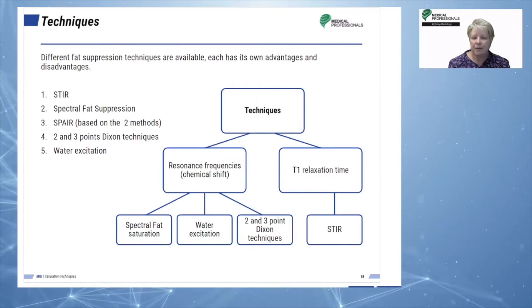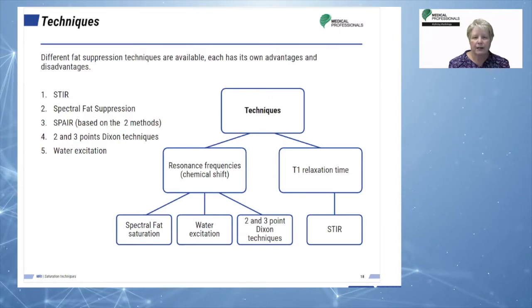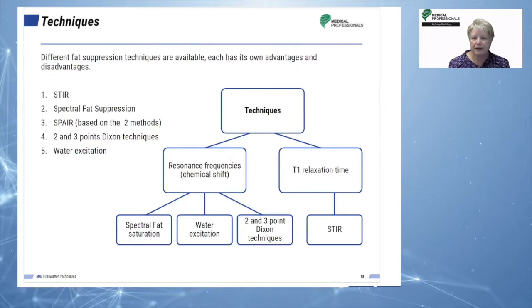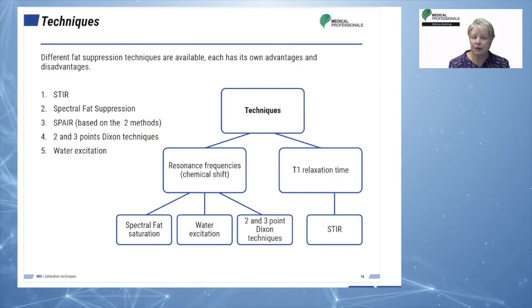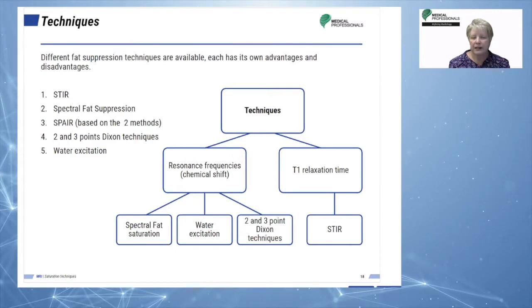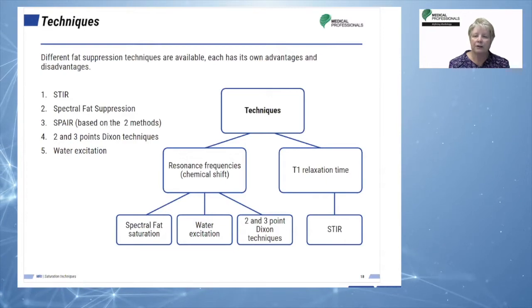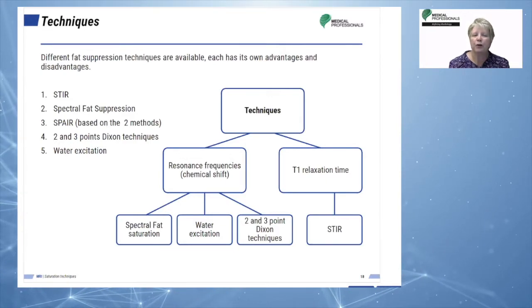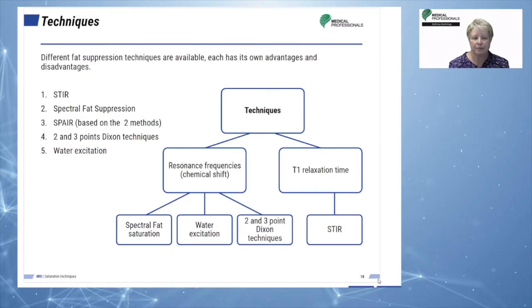The other technique mentioned was using resonance frequencies of the tissue, in this case water and fat, to suppress the fat. This, as you may recall, describes using chemical shift concepts. Examples of this are spectral fat saturation, water excitation, and Dixon techniques. As we mentioned, we will learn more about each of these individually in greater detail.